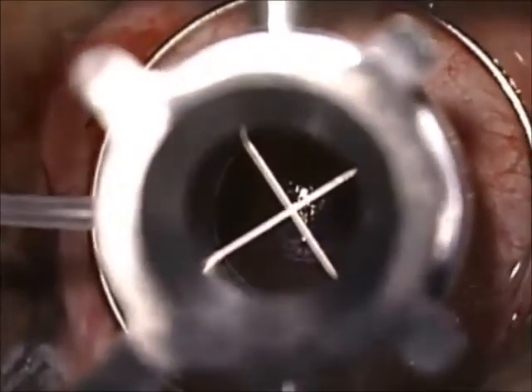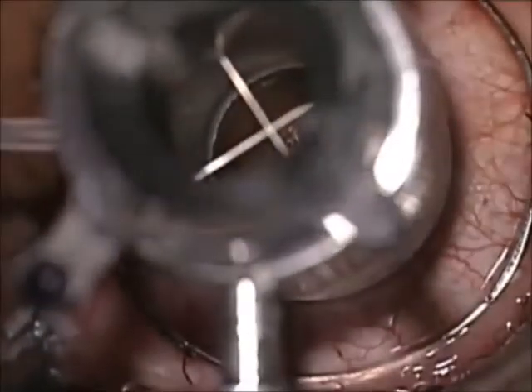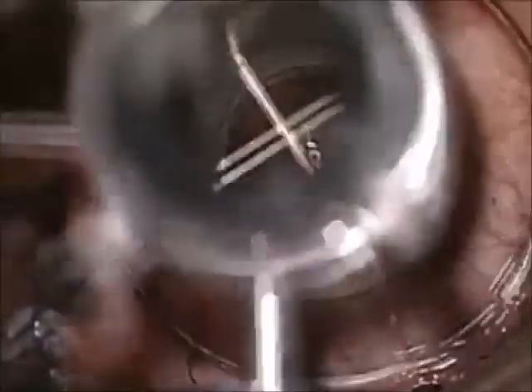Here the vacuum is tested. The indicator pin is used to rotate, and PK is achieved.